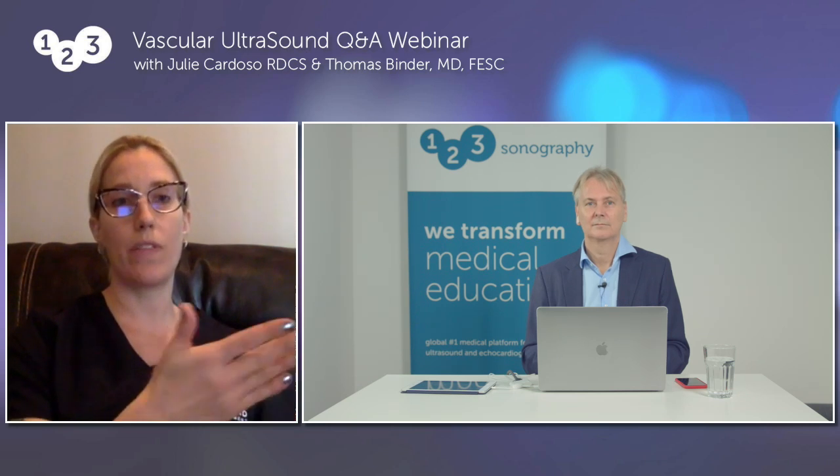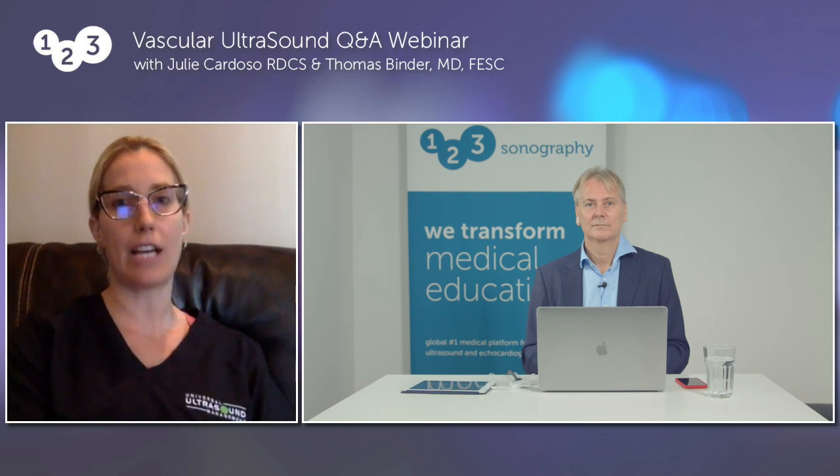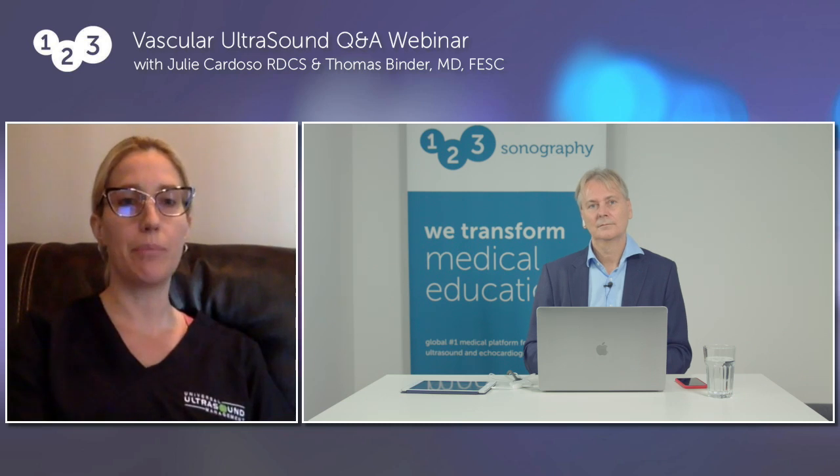And if the neck and the diameter are larger than a certain percentage, then they will have to either get a thrombin injection, which we'll do in office, or they'll have to go for surgery to tie off the actual vessel. So it all depends upon the diameter of the neck and the effectiveness of the compression maneuver, if we can close that aneurysm or the fistula.